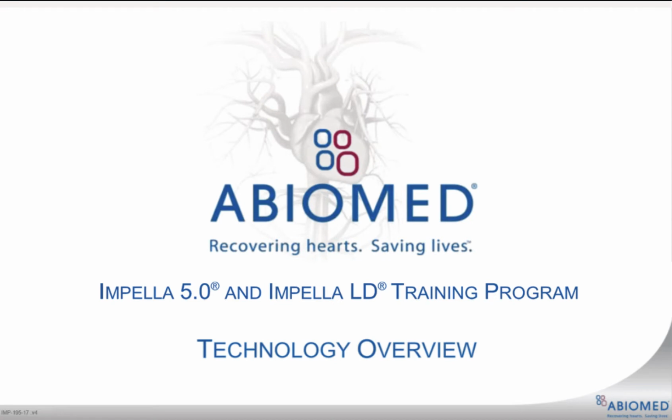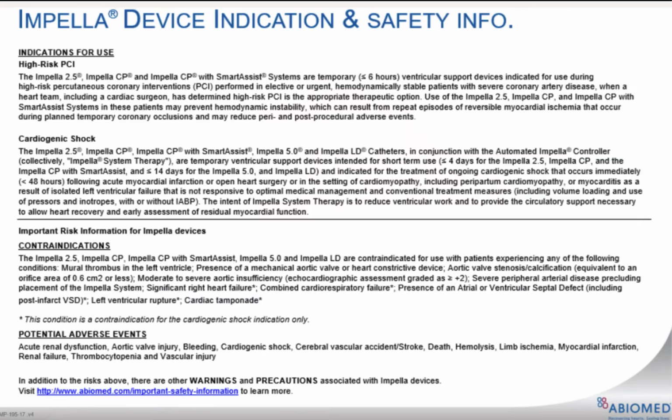Impella 5.0 and LD technology overview. The first course in the Impella 5.0 and LD training program. This course provides an overview of Impella 5.0 and LD technology, system components, and principles of operation of the Impella 5.0 and Impella LD catheters with the automated Impella controller. Please take a moment to review the Impella device indication and safety information. When done, click anywhere to continue.